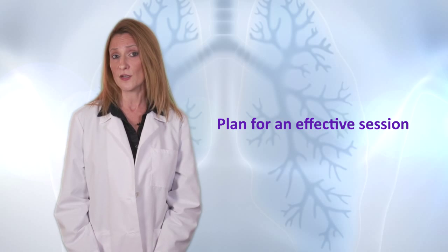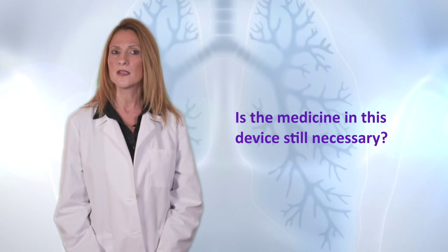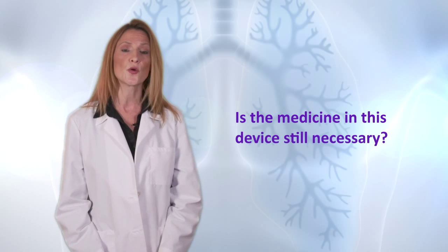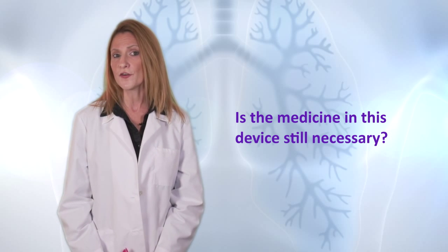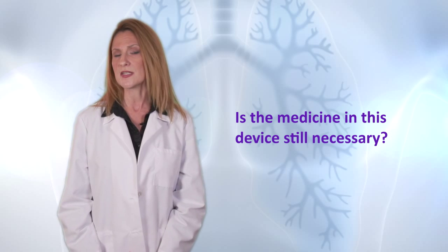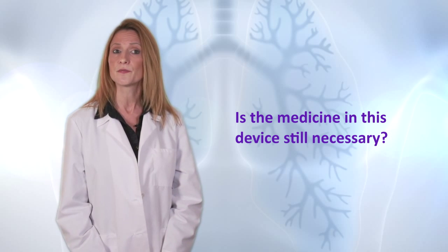In the companion videos, we discussed which medicines are available in the various devices. Is the medicine in this device still necessary? Respiratory medicines may be prescribed on a trial basis. If there was no benefit, the medicine might be changed or discontinued. A medicine may have been started for symptom relief until further tests are completed to confirm a diagnosis of asthma or COPD. If another condition with similar symptoms was diagnosed, such as heart failure, sleep apnea, or a restrictive lung condition, the medicine might also be discontinued.